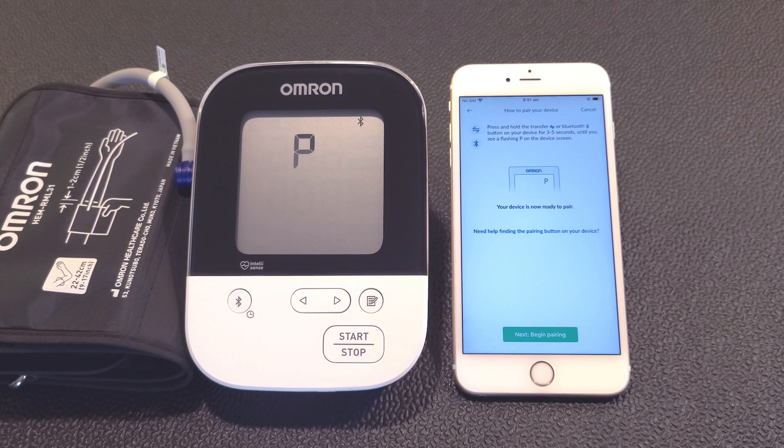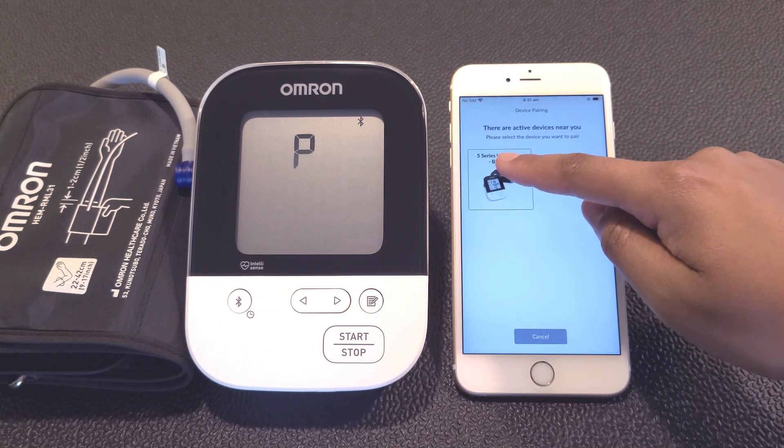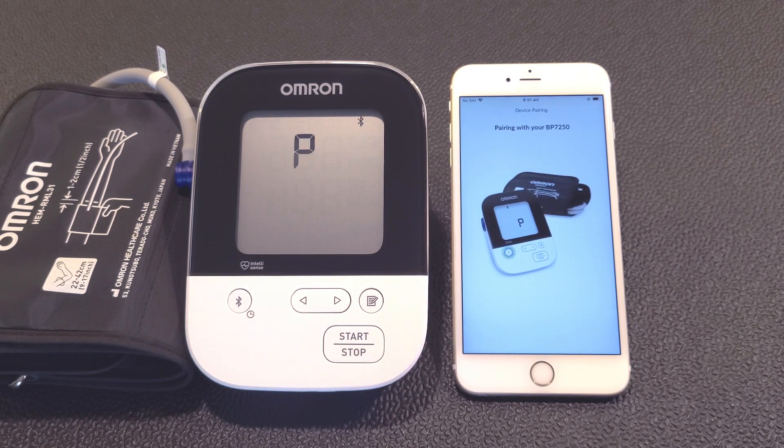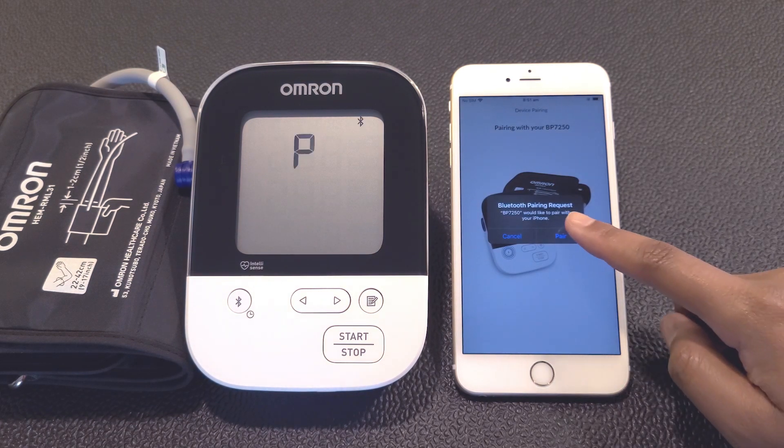Return to your smart device and tap the Next Begin Pairing button at the bottom of the screen. Tap on the photo of the device you wish to pair, then confirm your Bluetooth pairing request by tapping on Pair.